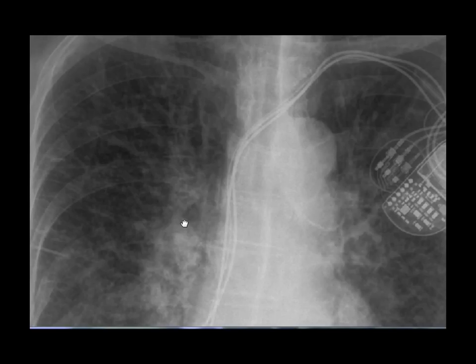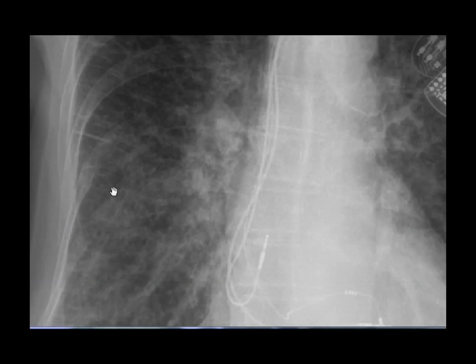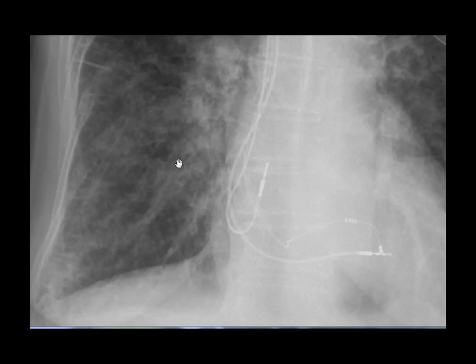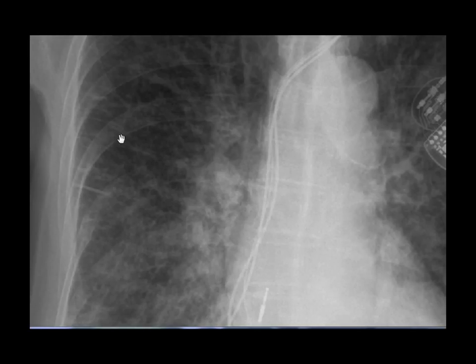Curly B lines are horizontal or almost horizontal lines that start from the pleura and travel towards the hilum. They have a maximum length of two centimeters and two millimeters in diameter, and are mostly visible in costophrenic angles. They become smaller as they move towards the hilum and become invisible after two centimeters.